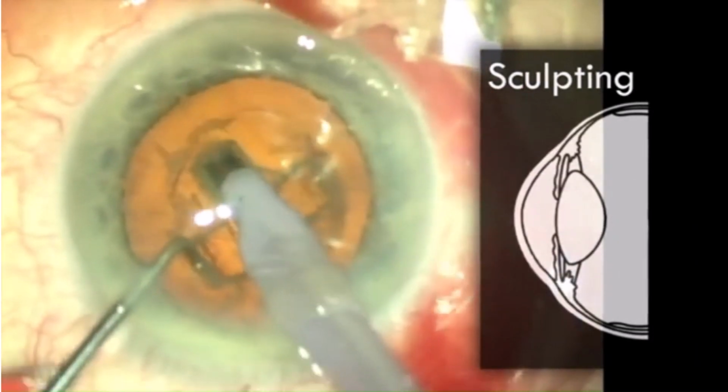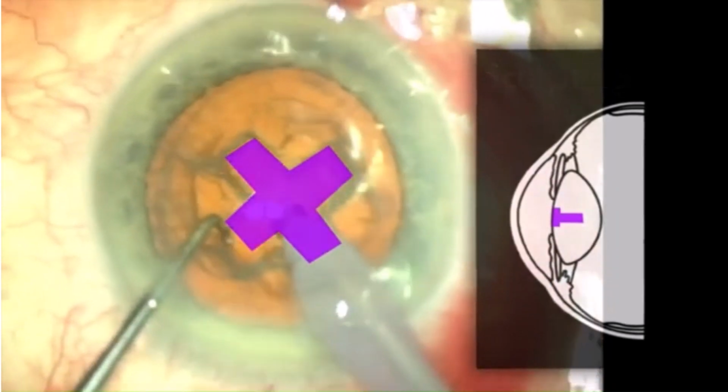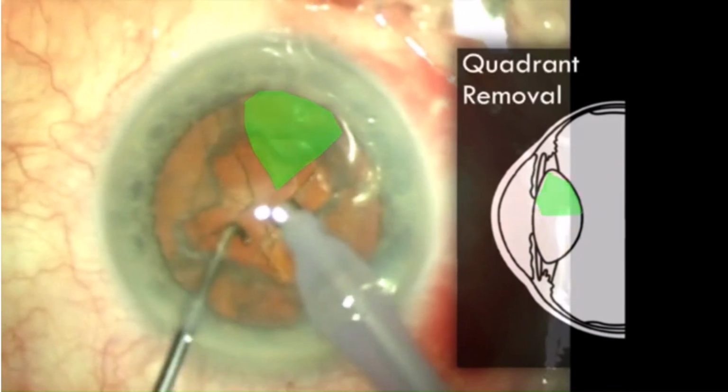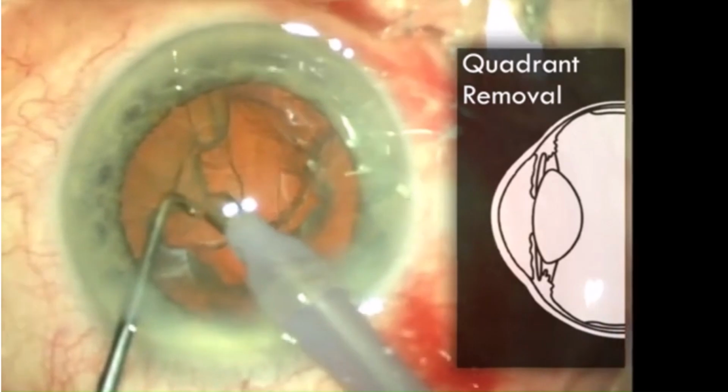See, hydrodissection is important anyway because you cannot just pull the cataractous lens out of the bag. You have to separate the cortex and the nucleus. Else, with phacoemulsification, there is a chance that the entire bag might be pulled out. It's a very powerful machine.